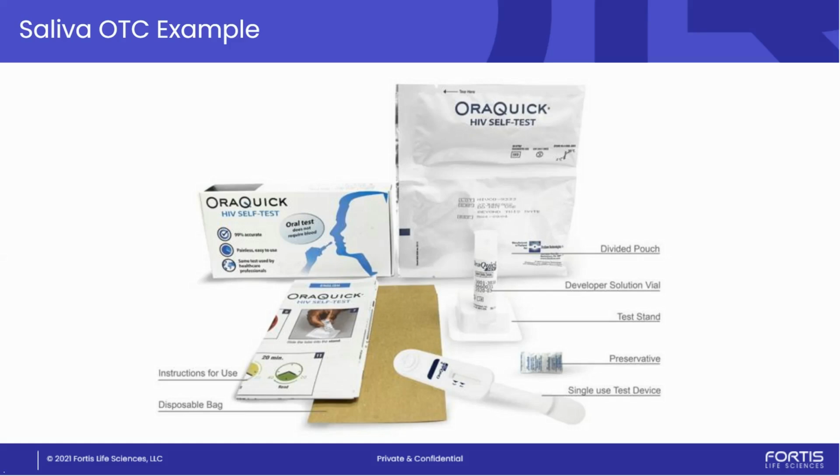When you go OTC, that means reduced complexity in order for it to be really approved by the FDA. And that's because there's a lot of human error involved in sample testing. And if you don't want a trained operator doing this in a CLIA lab, then you do need to simplify the test method. And that goes back into your considerations of what kind of product you want to make and where that test is going to be performed.